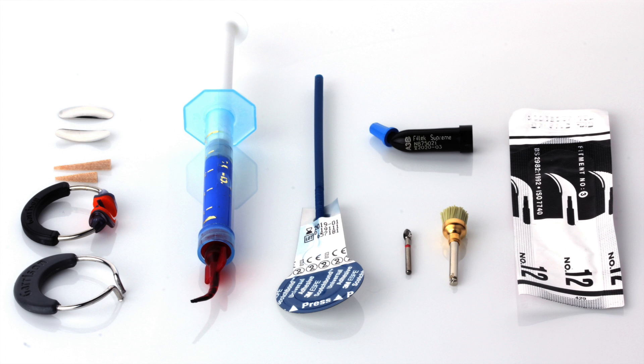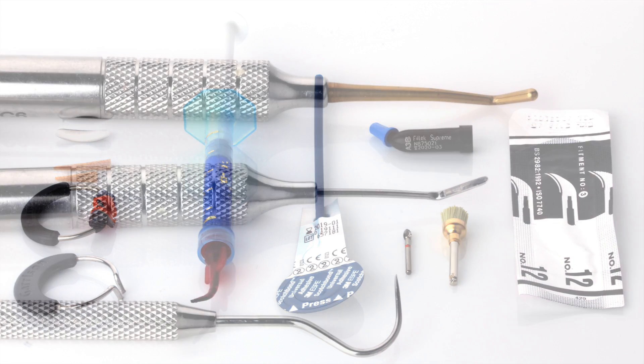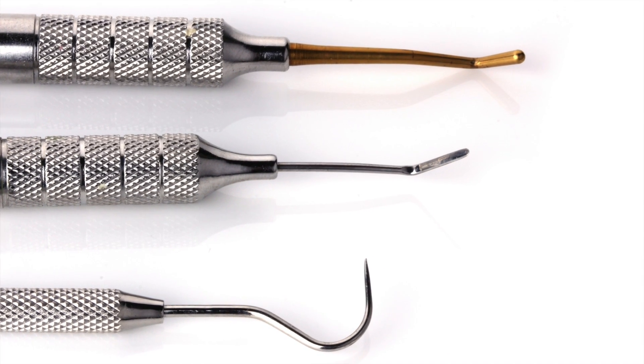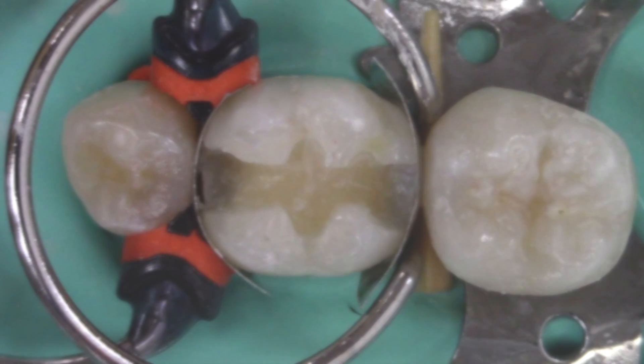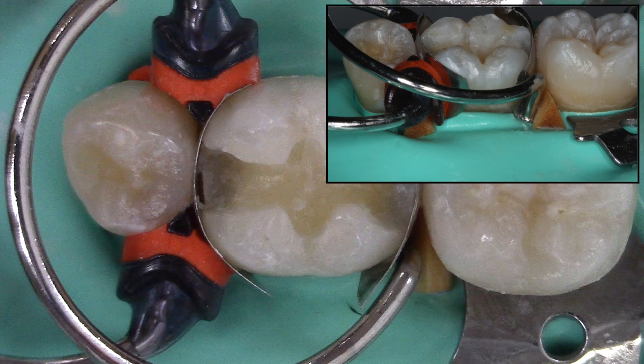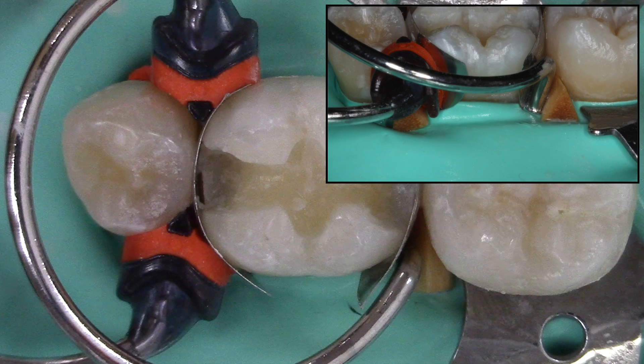The armamentarium for this procedure is ultra etch phosphoric acid etchant, Scotch Bond Universal bonding agent, Filtek Supreme body composite, resin composite placement instrument, interproximal carver, explorer, and light curing unit. This molar has been prepared with an MOD Class 2 preparation. The teeth are properly isolated with a rubber dam; sectional matrices, wooden wedges, and rings have been placed.